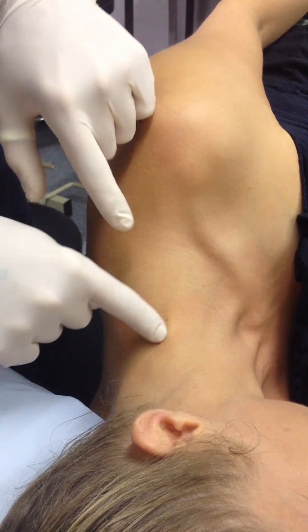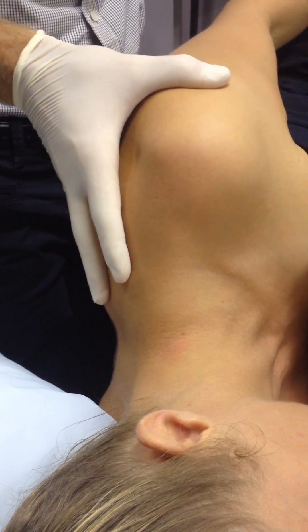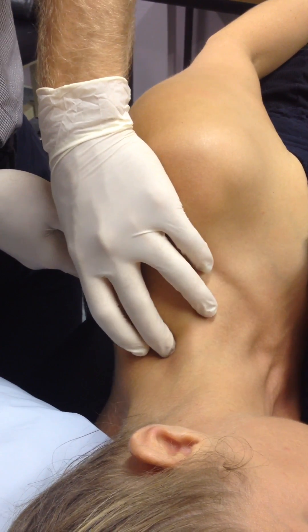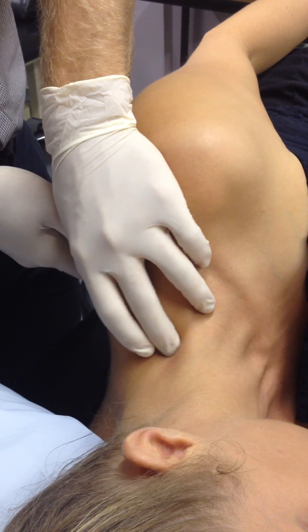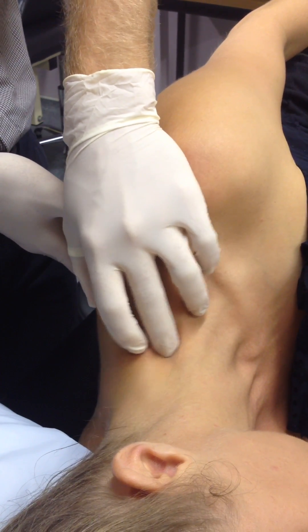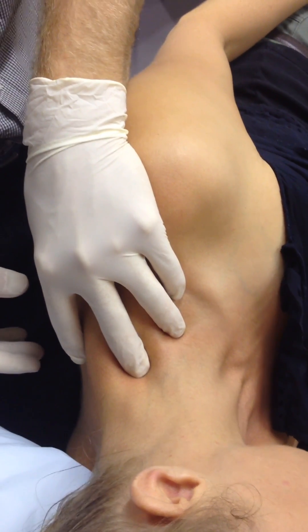If you're not quite getting that, think about the patient position. Also if it feels too tight, like really tight, then you can just move the arm or the scapula superiorly a little bit, which just takes the tension off it. So you can see that's a much softer type flick than what it was before. See how that's much quicker? It just gives you a bit more space and then you can also pull it off the thoracic wall a little bit more as well.